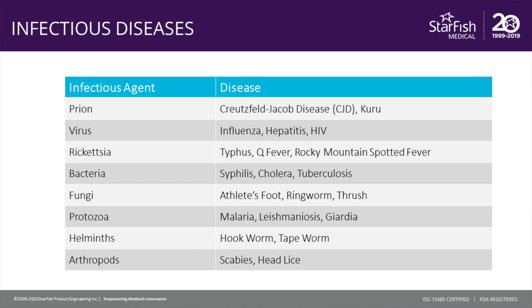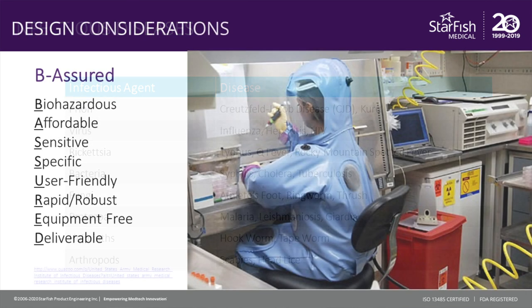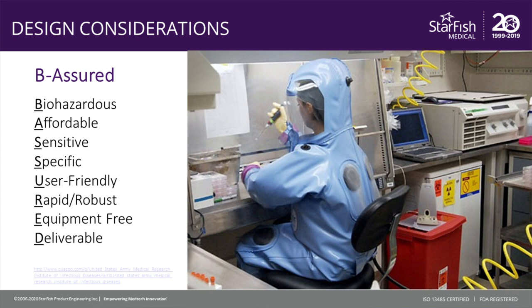And when we're designing infectious disease diagnostic platforms, we're trying to detect the presence of this cast of characters and help the clinicians make informed decisions about treatment options or the presence or absence of this condition. So in conclusion, then, I'd like to offer you a take-home message, and that is if someday you're tasked with developing an infectious disease point-of-care diagnostic platform, I'll offer you a nice mnemonic to take home and to think about when you're doing that.